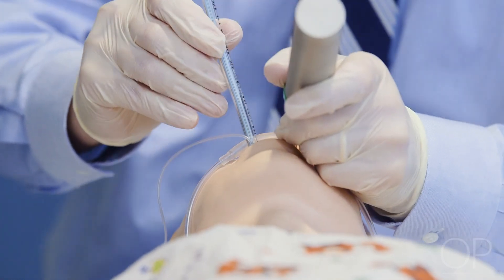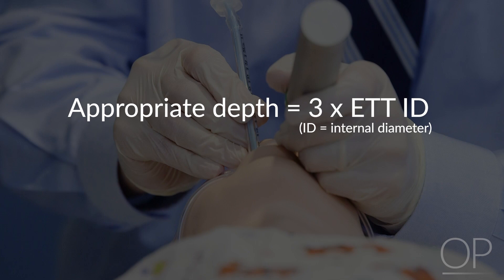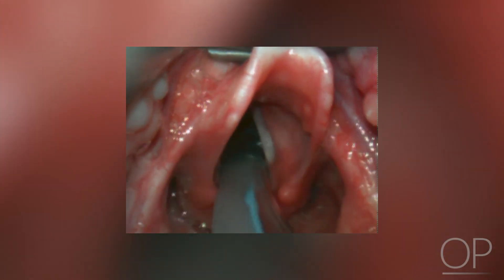The tube should be advanced into the trachea to the appropriate depth. A general guideline for depth of insertion is three times the internal diameter of the endotracheal tube when an uncuffed endotracheal tube is used. A cuffed endotracheal tube should be advanced until the cuff passes just beyond the vocal cords, and the cuff should be inflated.